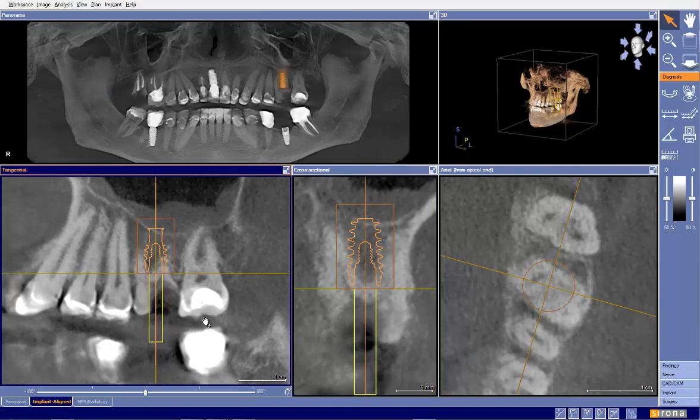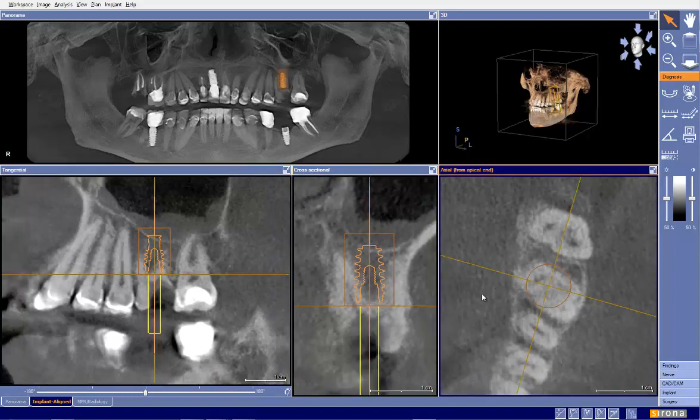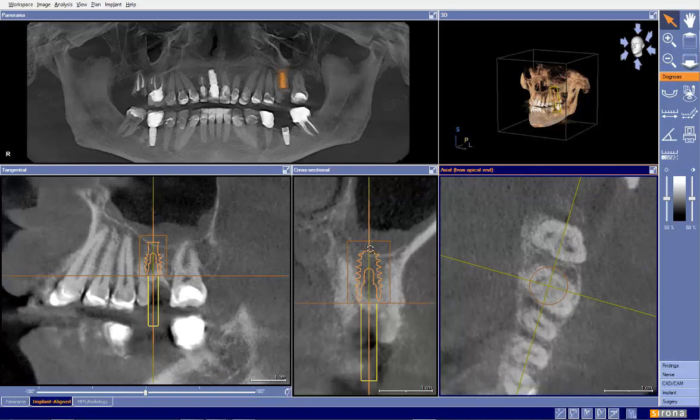The benefits of an immediate placement are less trauma for the patient, less visits for the patient. The other risk that we have is by when we do this graft here, there's some chance that there could be pneumatization of the sinus here. So, we just want to minimize some of those risks that we take, and certainly beneficial time-wise, and truthfully, it's not significantly more time to go ahead and place the implant at the time of extraction.